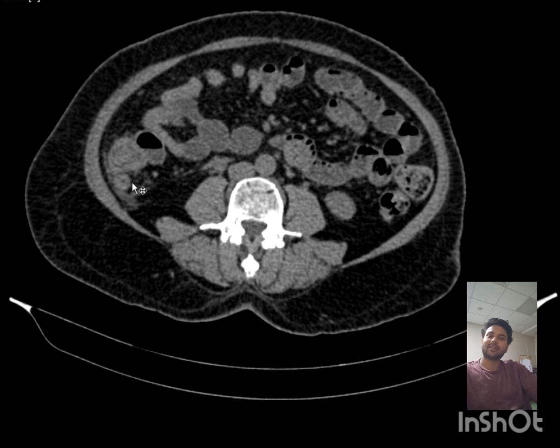So this was a case of appendicitis that was very difficult to visualize initially in ultrasound because of the classic location of a retrocecal appendix. In such cases, ultrasound can be very difficult, because if you put a probe at this place, all of the air that is present in the cecum is going to obscure the field that lies posterior to the cecum and thus obscure the appendix.